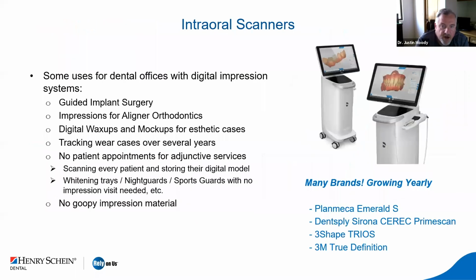We can use intraoral scanners for a variety of modalities within our dental offices, and we'll find these in different shapes. There's lots of different brands available out there.